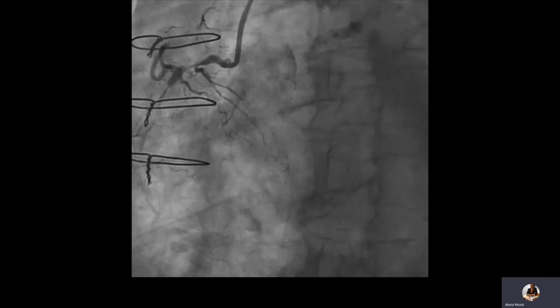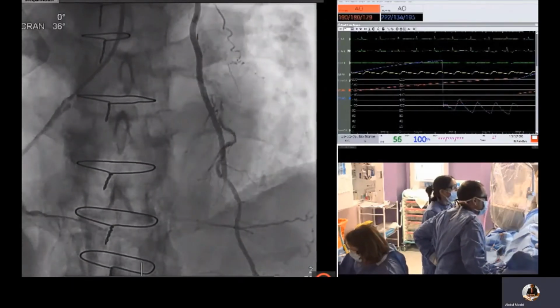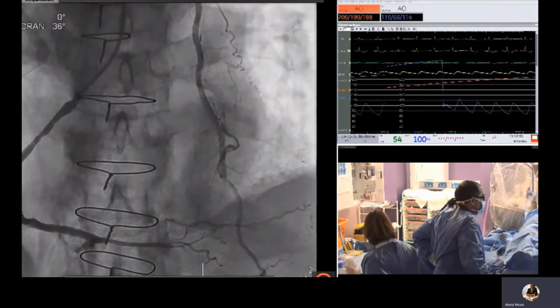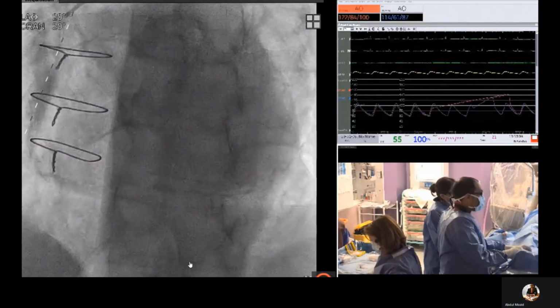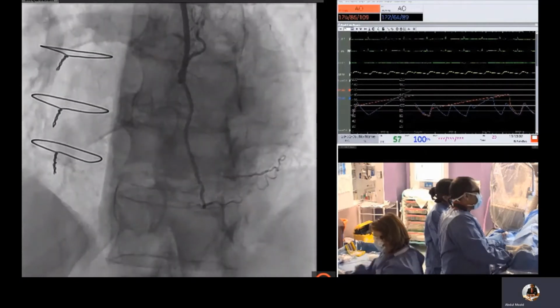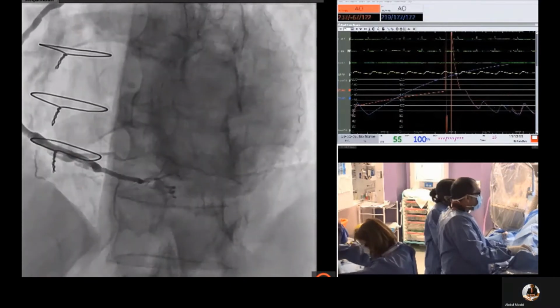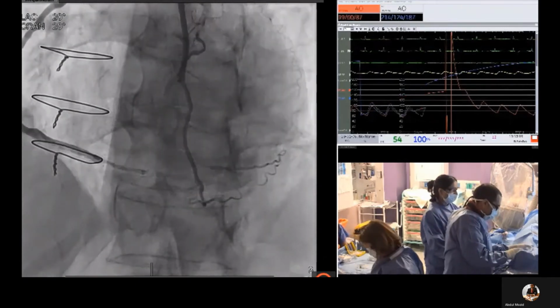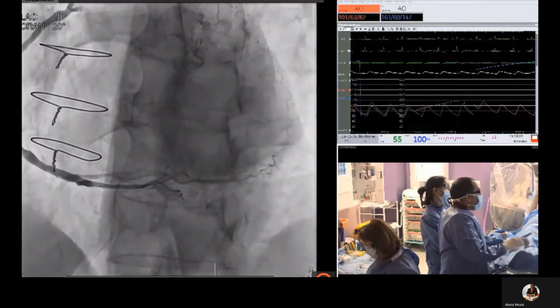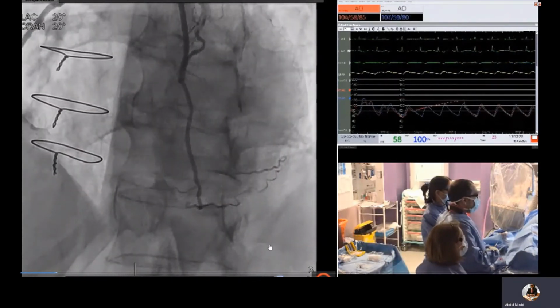And so here, this does clarify that there is an occlusion of the PLV branch, which will need separate antegrade wire escalation technique. After the native RCA is recanalized, the graft to the PDA is nice and healthy with good distal PDA. Here is another view, dual injections from the vein graft and the LIMA. This again shows a short occlusion of the PLV branch.